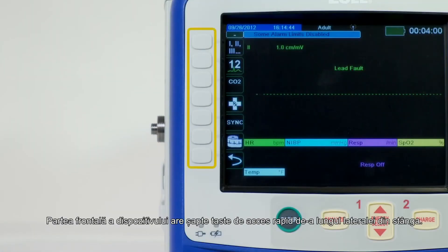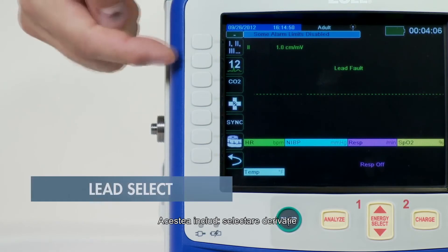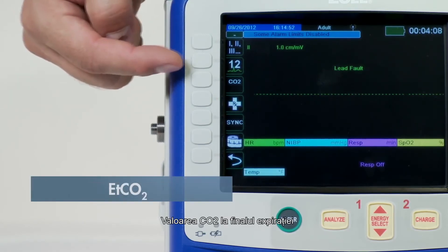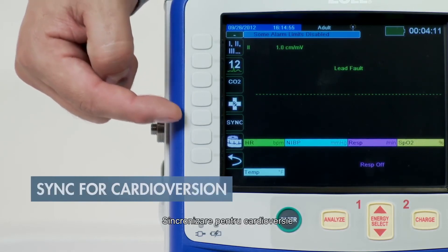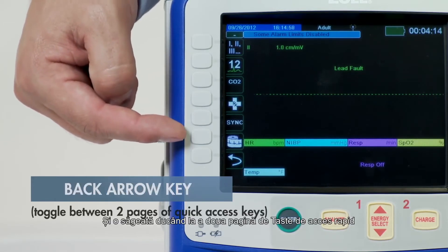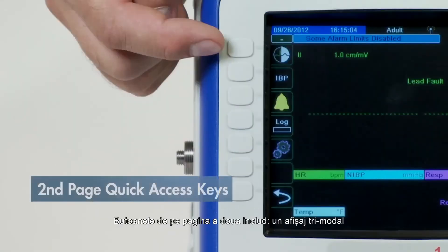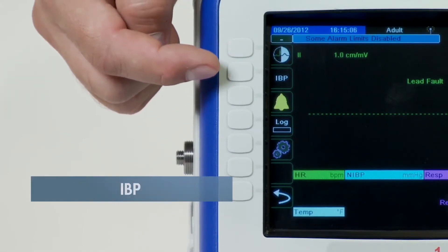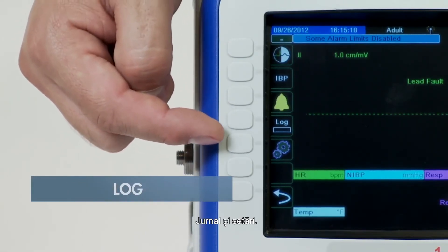The front of the device has seven quick access keys along the left side. With these quick access keys, you can perform 80% of all functions with no more than two button pushes from the home screen. These include lead select, 12-lead ECG, end-tidal CO2, code markers, sync for cardioversion, print, and an arrow leading to the second page of quick access buttons. Page two buttons include a tri-mode display, invasive blood pressure, alarms, log, and settings.